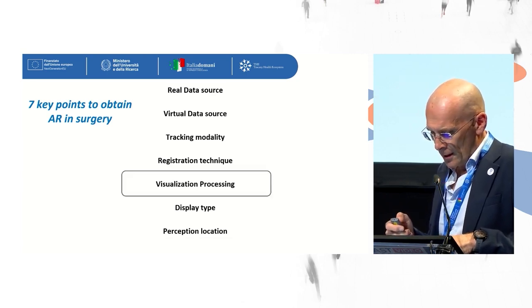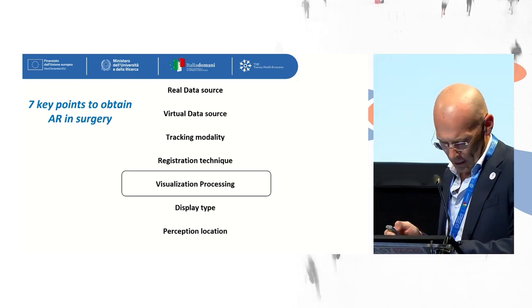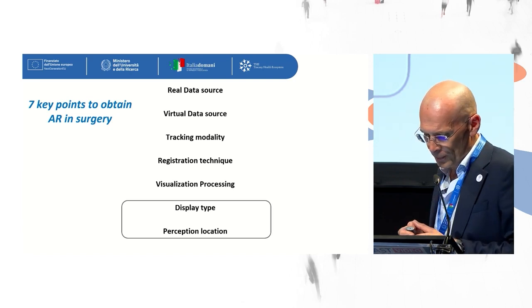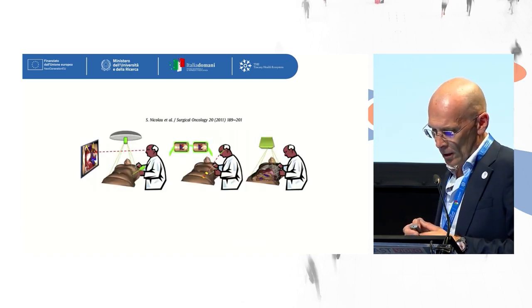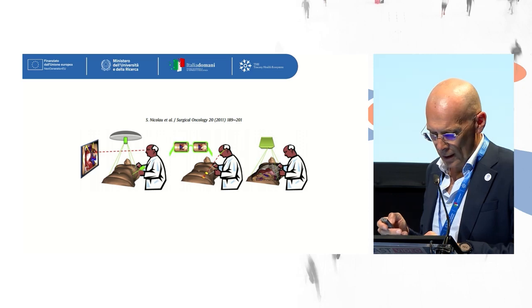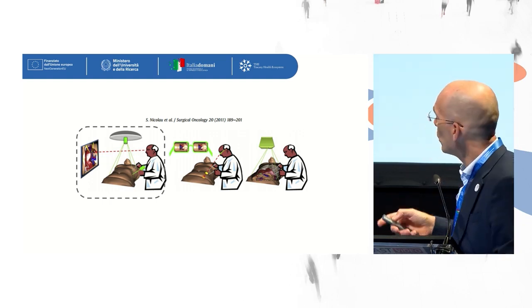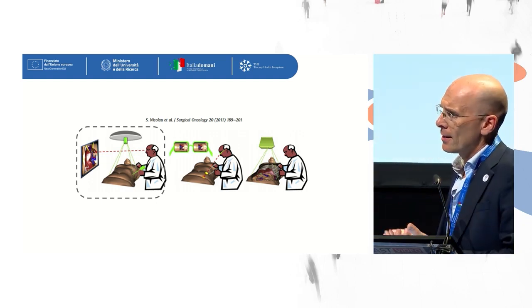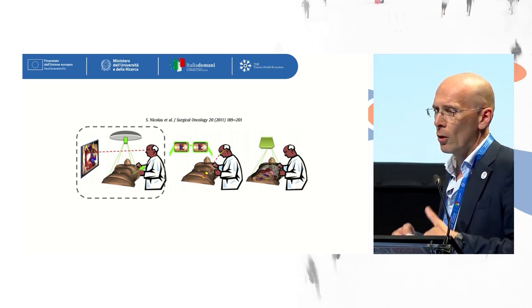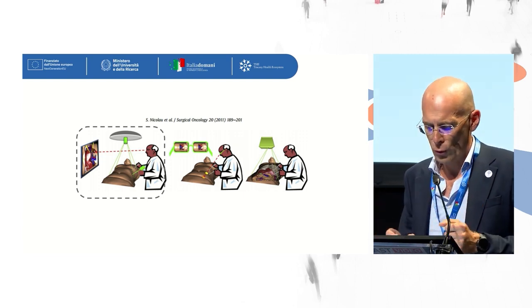Okay, in any case, the take-home message is that the virtual X-ray view is often not so useful. Finally, moving to the display, there are different kinds of display. Starting from an eye level, we can use the traditional display used by the surgeon during endoscopic intervention. So in case of an endoscopic intervention, the surgeon can visualize this kind of information directly using the same monitor used to visualize the anatomy through the camera.